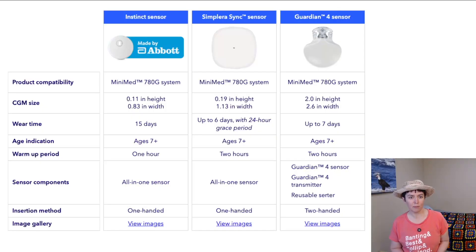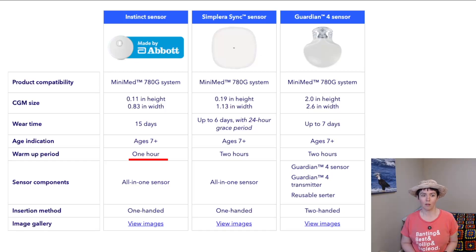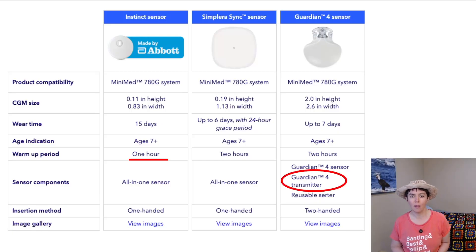These are the three CGM sensors currently available for the MiniMed 780G insulin pump. The Instinct sensor has a one-hour warm-up time, unlike the other two which have a two-hour warm-up. The Guardian 4 sensor is different because it has a separate transmitter that you connect to the sensor, and the transmitter is reusable, whereas the other sensors are all-in-one. That's important because if you're using a Guardian 4 transmitter and having sensor issues, there are additional steps you can try, whereas the other two all-in-one sensors can't be disconnected from a transmitter.